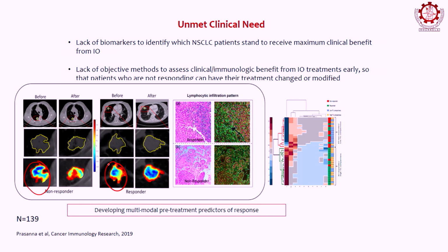So, what we did was we computed the collage features, and you see that there is some level of difference of the collage features for the patient who responded to therapy and the patient who did not respond. But what was more interesting is that after therapy was given, when the patient came for follow up, if you look at the texture differences, you clearly see that the non-responder had a different change of the radiomic features as compared to the responder. For the responder, you will see that the radiomic features probably did not change a lot. For the non-responder, they changed a lot, right? So, you clearly see that there is something happening to the texture of the lung that is different between the responder and the non-responder.